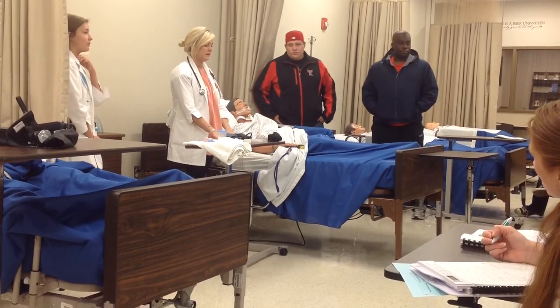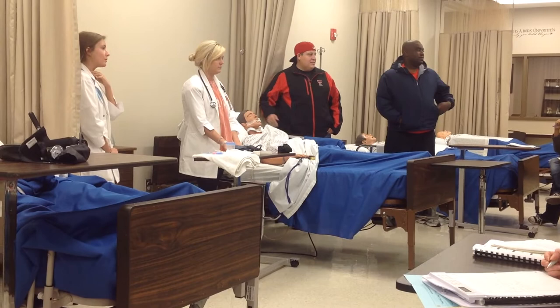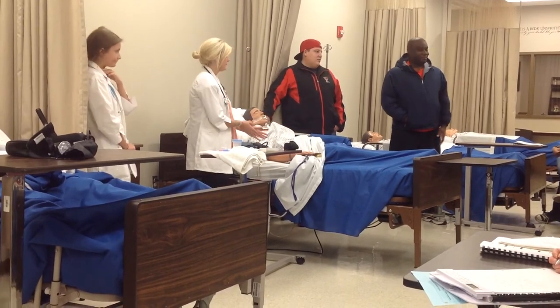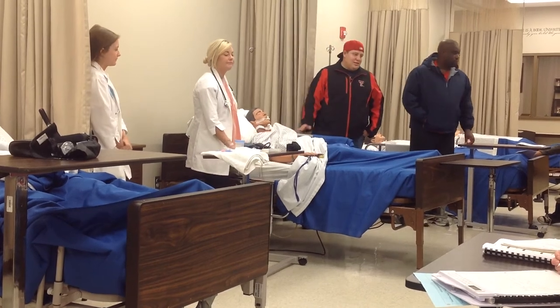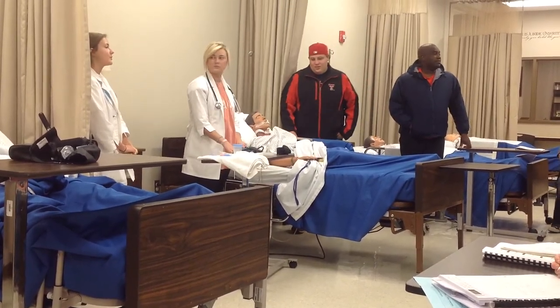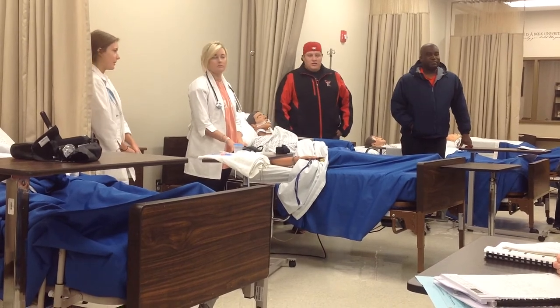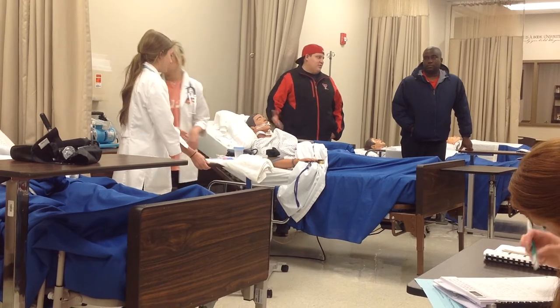Are we doing the respiratory assessment before we place it as well? Well, if they're choking, you don't have time. This is an emergency situation. So you do assess, but you do it quickly. But as soon as you insert the oral airway, you need to, because usually they do have some type of oxygen or something because they're unconscious.